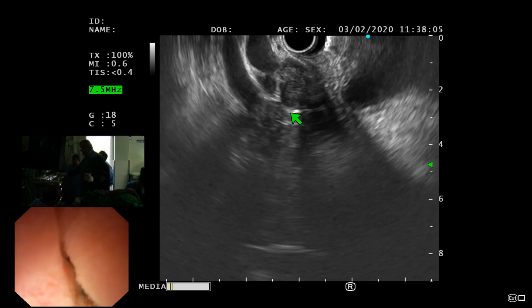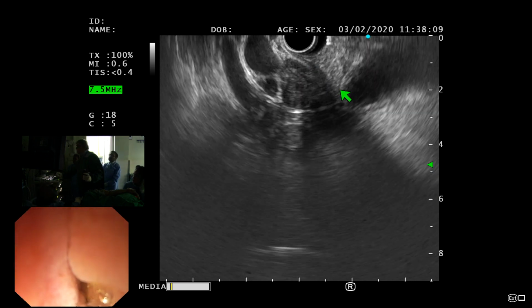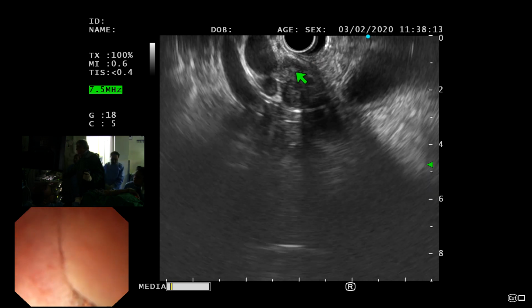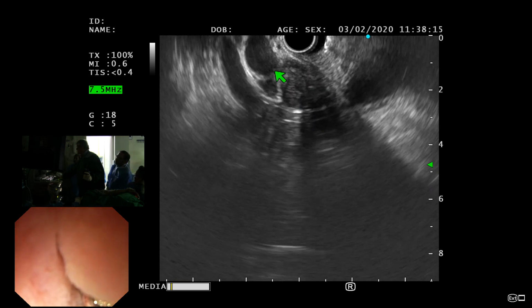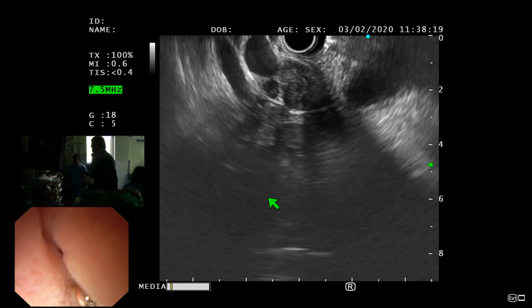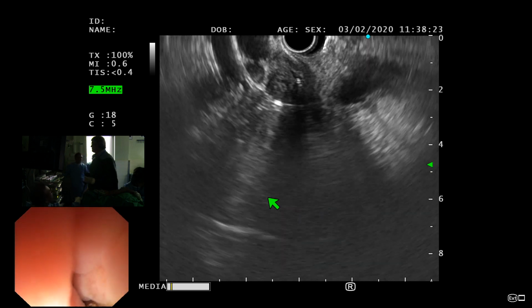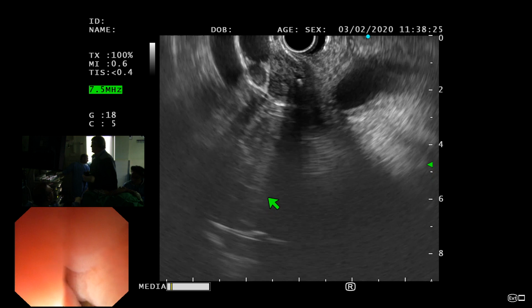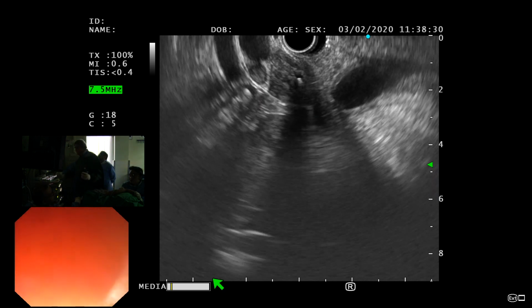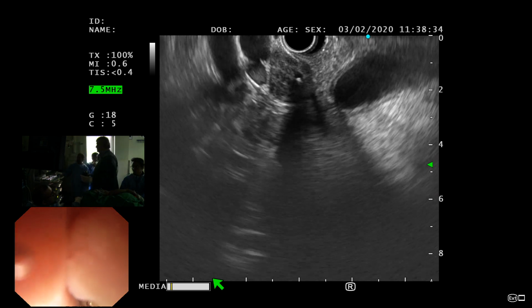So to me, Khalid and Riyas, this whole area. Yes, this whole area is abnormal. Okay, so what I would do is I would obviously take samples from here. I think this patient history-wise also looks to me like as if she's got cholangio, distal cholangioCA. There's one lymph node here. So I'm going to try and see if I can go into the.